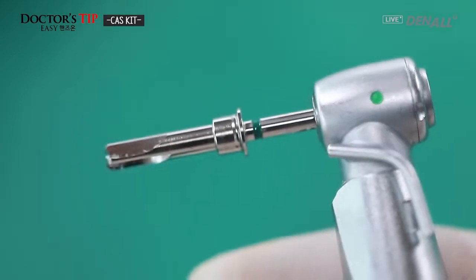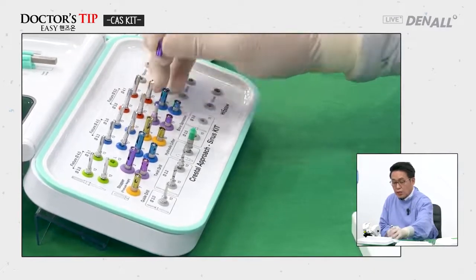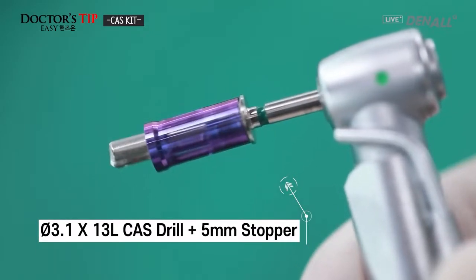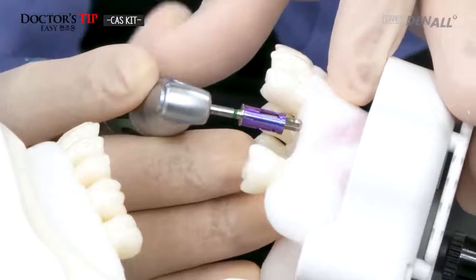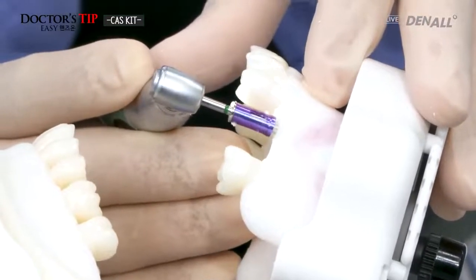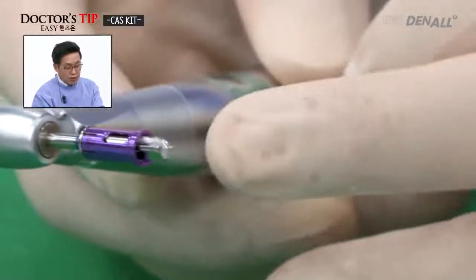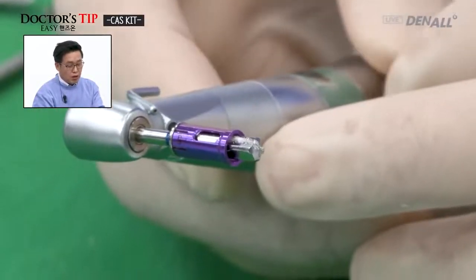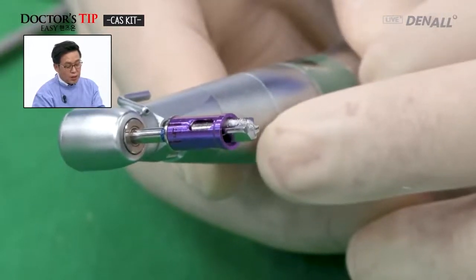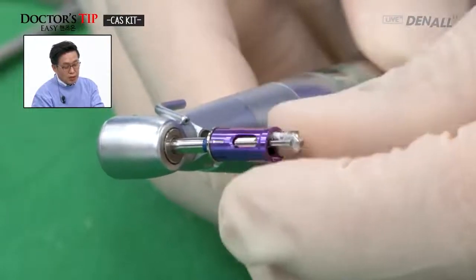Using method 3 that I explained, 1 millimeter advance will be made. A 5 millimeter stopper is connected. The residual bone height is 5 millimeters. The 5 millimeter stopper is connected to the CAS drill. So whether the sinus floor is penetrated or not will be checked.